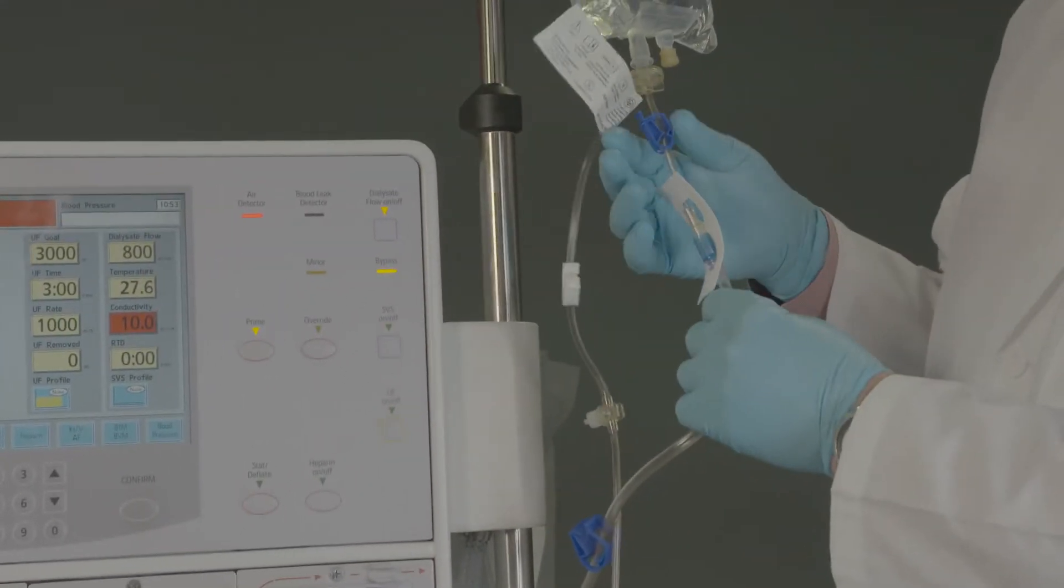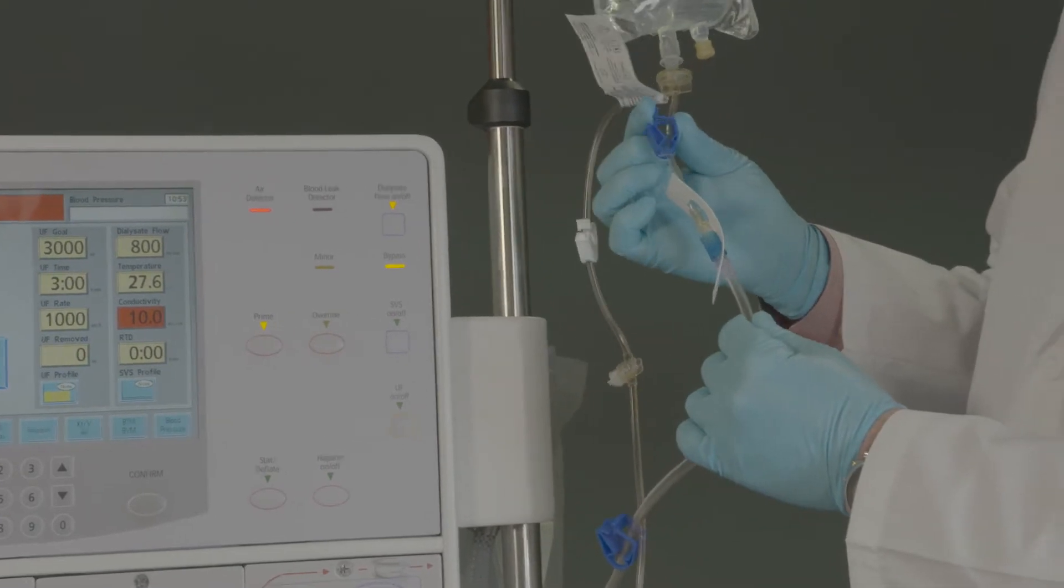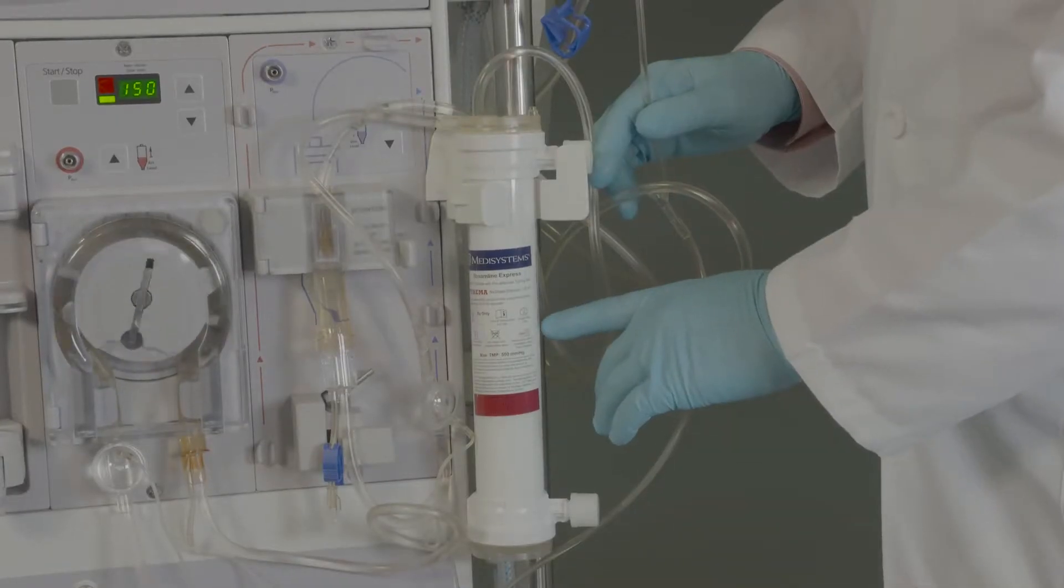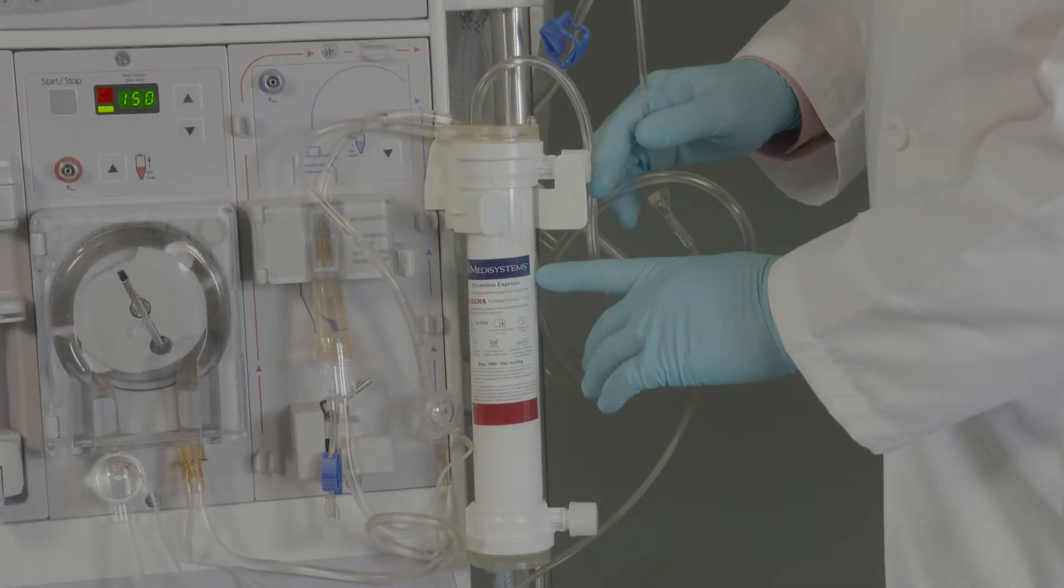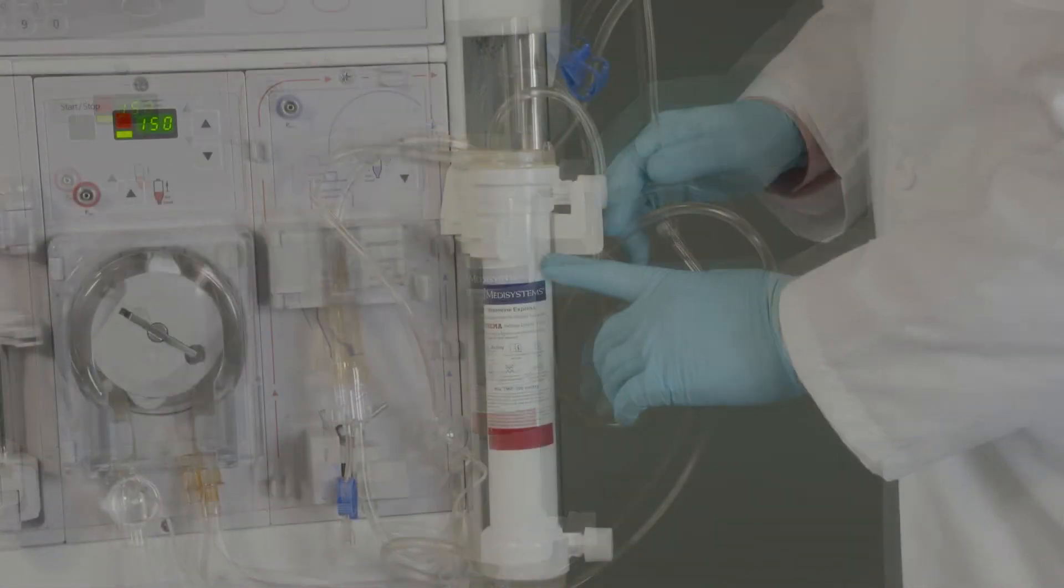Start the pump, then open the small blue clamp on the dual lumen spike. Allow the dialyzer and inverted venous chamber to fill until air is expelled. The pump will stop upon completion of prime volume.